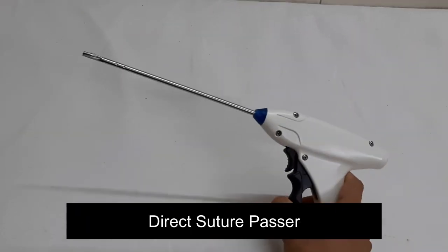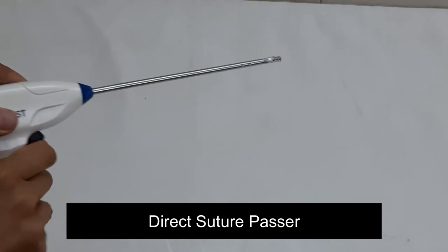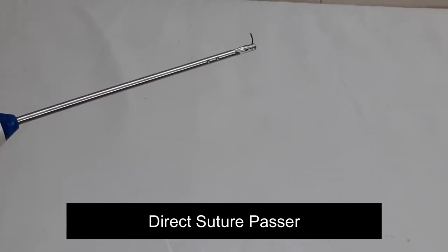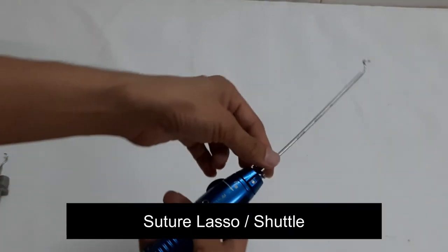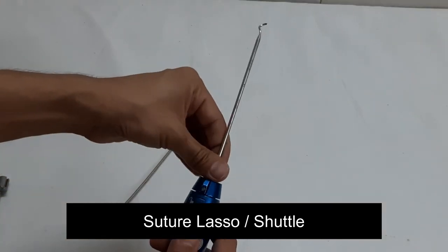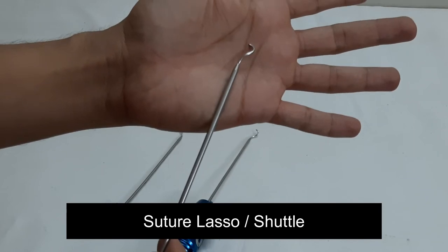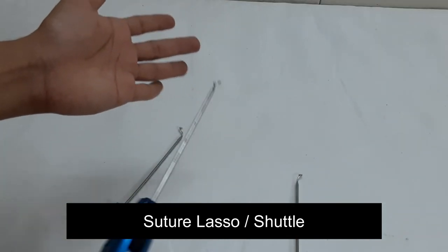This is the direct suture passer. Suture from the anchor is loaded onto this device, which is used to grasp the tissue and take a bite to pass the suture through the cuff or labral tissue. It comes in various angles — left, right, straight, 25-degree, and 45-degree curve.